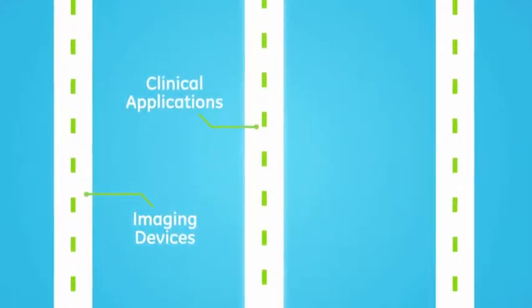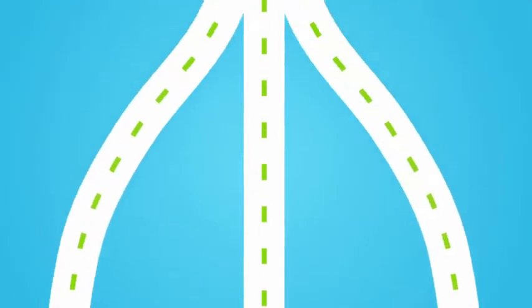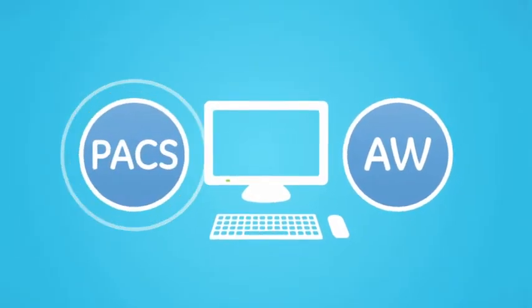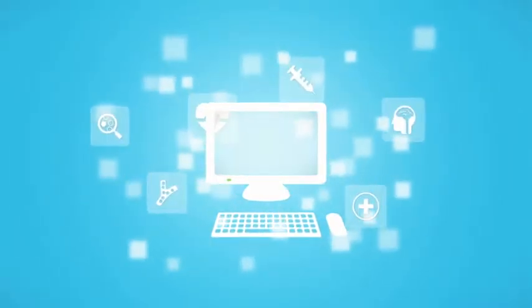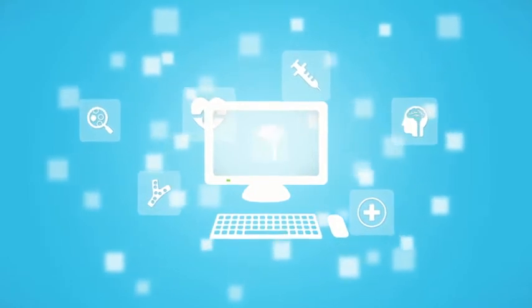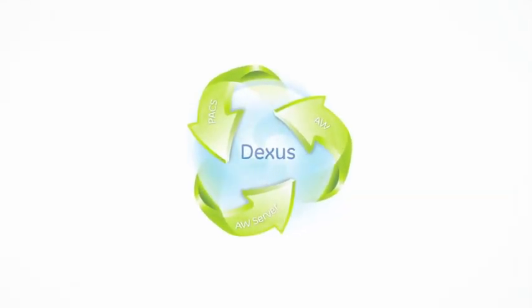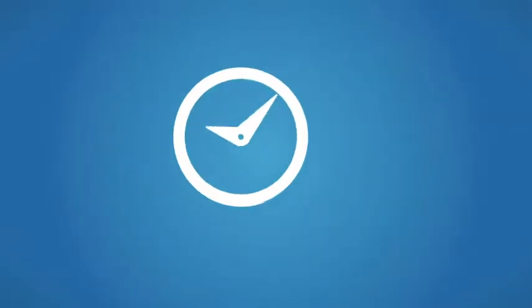But what if there was a streamlined workflow that brings a radiologist's productivity tools together on one desktop? One that merges GEAW Clinical Depth and Centricity PACS platforms, offering a full range of advanced applications delivered wherever and whenever you need them. That's the power of GE's DEXIS workflow environment. So let's start the day over with DEXIS.